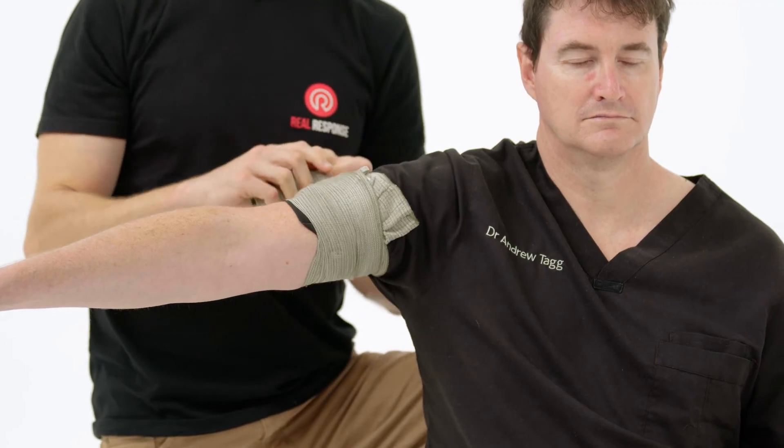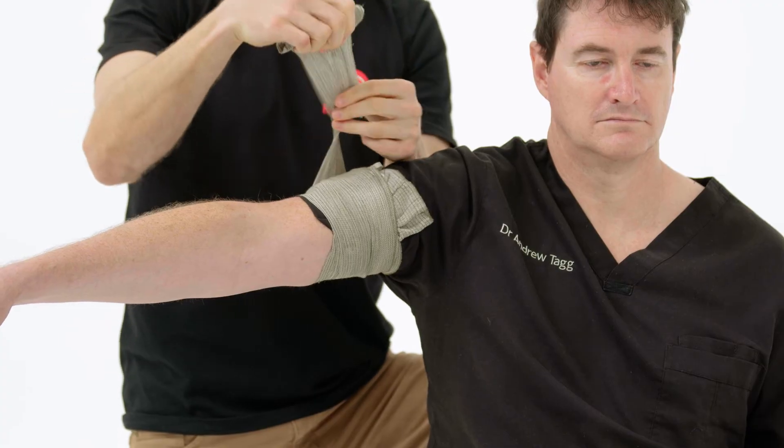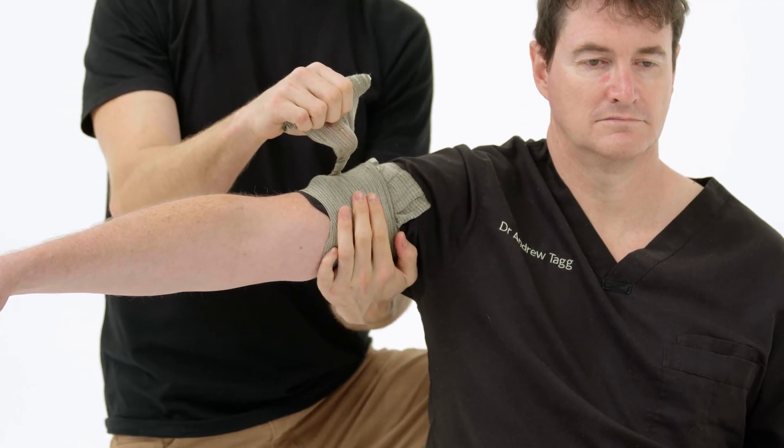If you feel like you need to apply more pressure, get a little twist in the bandage — a 360-degree twist — and make sure that twist applies pressure straight over the dressing area.